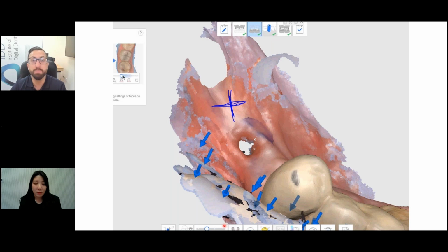If you find it's beneficial for you, and in some difficult cases it can be, then this is the button that Sue was mentioning. It's a little cut off, but down here, and I mentioned it previously in the webinar, this is where you can control the AI. And so I just keep it at 2 for the vast majority of indications.